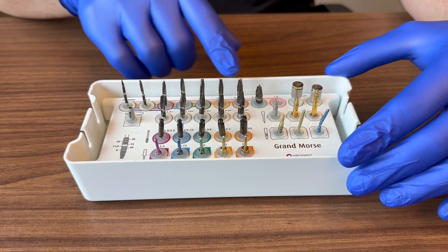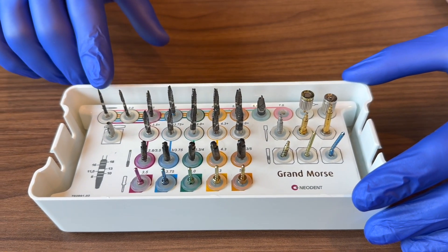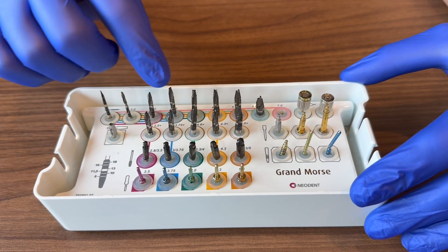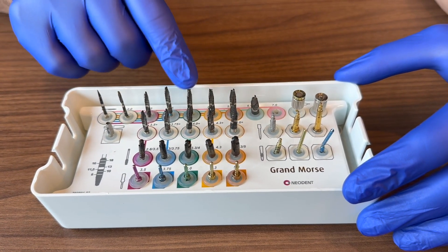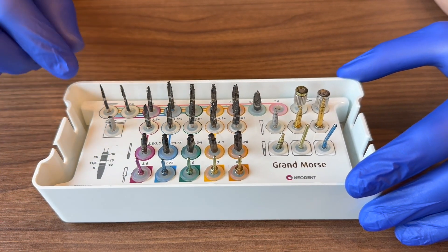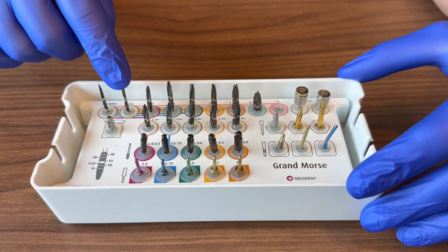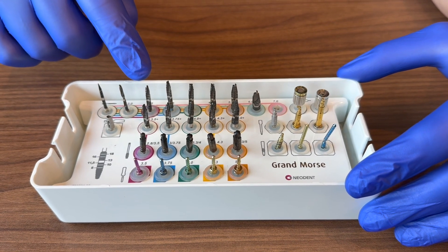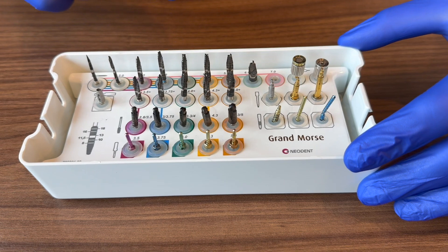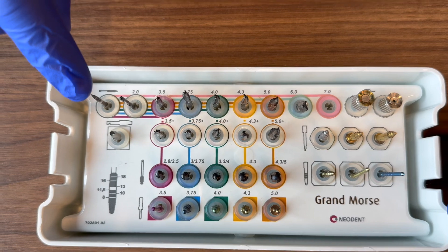If you're placing an implant, focus on the top row of the kit. The great thing about Neodent is you run through the same sequence every time and simply stop at the implant size you need. You start with your pilot drill, then your 2.0 twist drill to length, then progress through the implant-size drills to length.